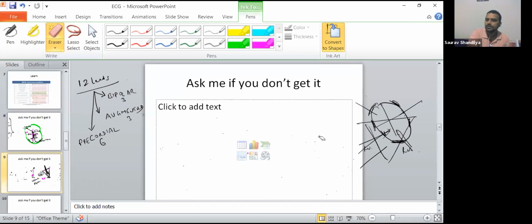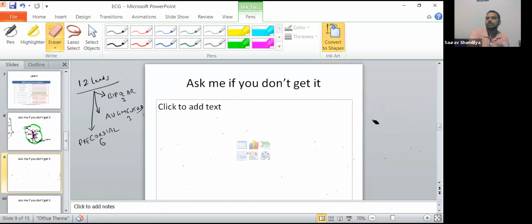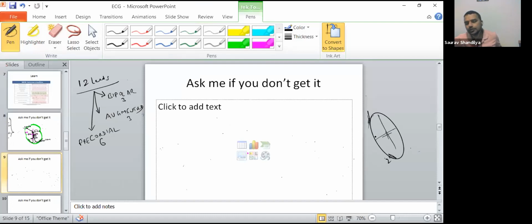Don't get confused. Those who are getting confused, please try to understand: the augmented leads are just three more views to create your own heart recording, some more recordings. One more time, I'll explain simply. Suppose this is your heart. You had two views by bipolar leads, one view is two recordings, but you want to record something more, to know something deeply. So they created a resultant vector like the augmented lead. Now you have 3, 4, 5, that sort of recordings, right?